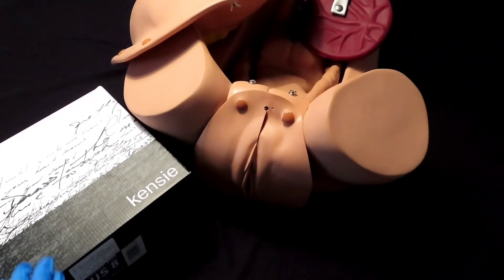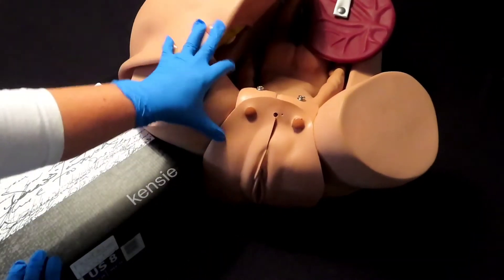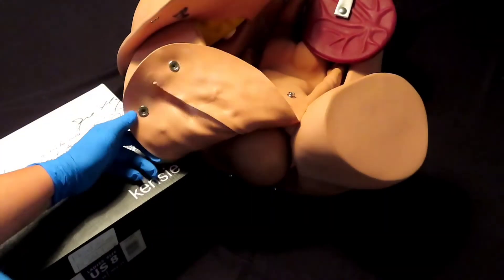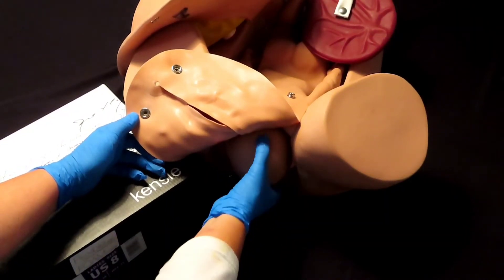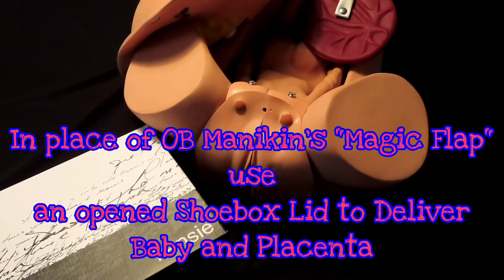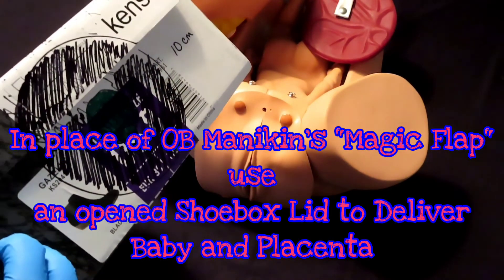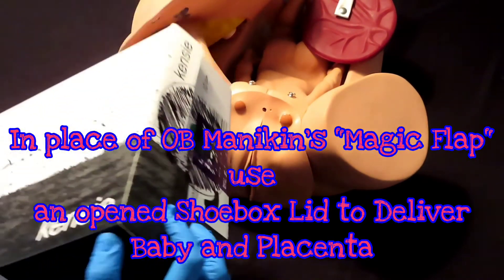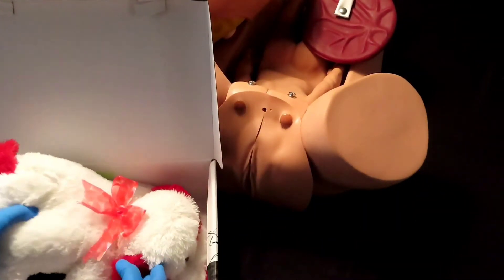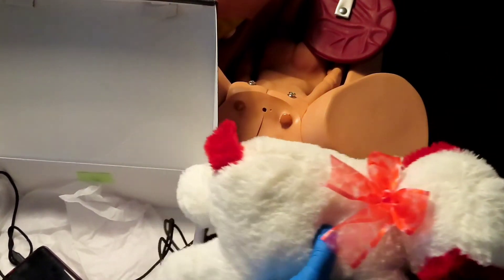The best comparable to 10 centimeters is this big can of pinto beans. When using the OB kit, the baby is inside underneath the abdominal pad which you're removing. At that point, the magic flap goes up and here comes the baby. In lieu of all of that, we're going to use the shoe box. You know what you're looking for with crowning and the 10 centimeters of dilation for the baby to come out. This is our magic flap — we pull that out and pretend this stuffed animal is being delivered.